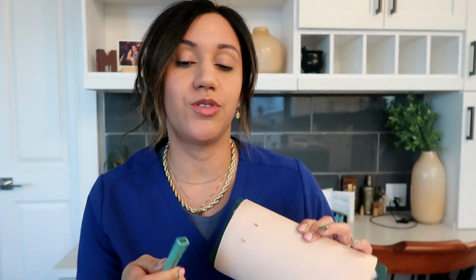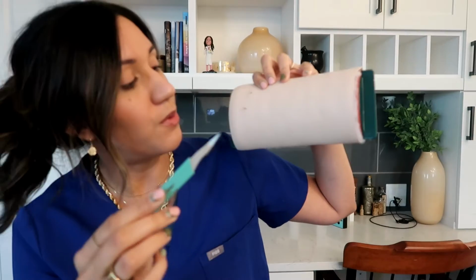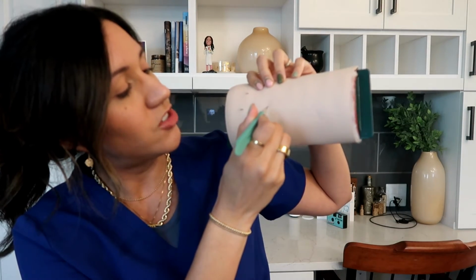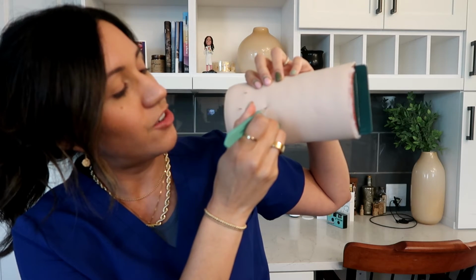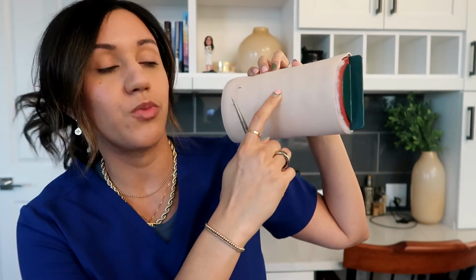Now the removal part can look a little bit more gruesome, I guess, because we do use a scalpel to get out the implant. So again, you have that area numbed. I can feel exactly where the implant is. I take my scalpel, let me feel again, and I will make an incision right underneath wherever I feel that Nexplanon. Let me protect my knife. Again, remember during all of this that your skin is numb. You're not gonna feel that sharp stabbing pain of the knife, but it's normal to feel pressure.